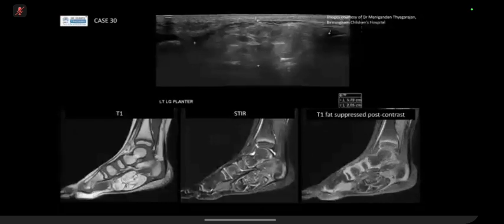Okay, so in lipomas, you can sometimes get a little bit of internal enhancement. So on ultrasound, you can have a little bit of internal vascularity, and you can also sometimes get a bit of septations. I think what's more, if it was a liposarcoma, then what you're looking for is nodularity, of course, and enhancement of that nodularity. But just also remember, this is in a child versus an adult. A lot of those criteria, although they can also be applied to a child, are often applied in the adult population.